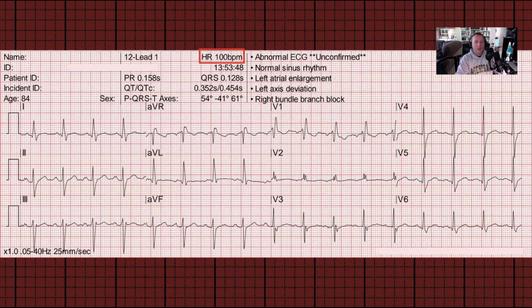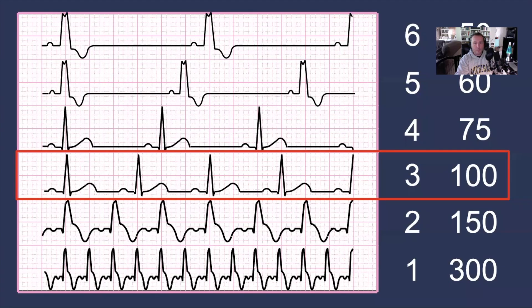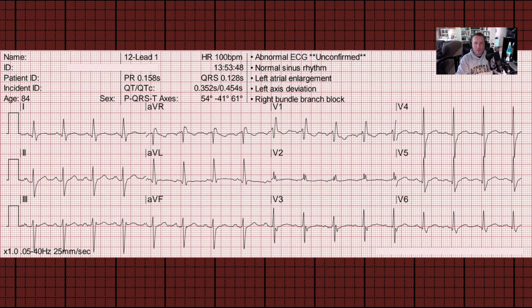How about 100 beats a minute? In that instance, we should have three large blocks in between cardiac cycles. Looking at this ECG and starting right here, we count out one, two, three, proving that this heart rate is being accurately measured at a rate of 100.